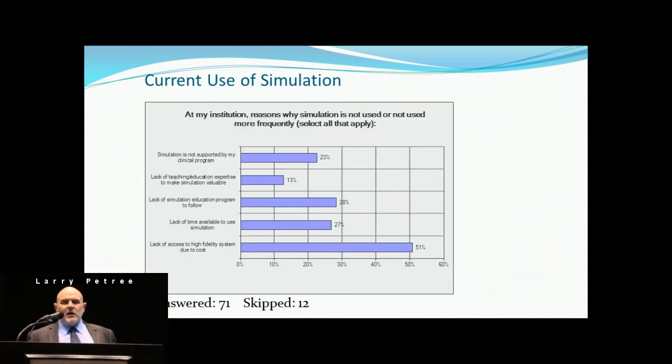So I want to switch to talk about the current use of simulation. How's it being applied today? I asked the question, at my institution, what are the reasons simulation is not used or not used more frequently? The largest response, down there at the bottom, is lack of access to a high-fidelity simulation system due to cost. And that came in at 51%. The next groups were that it is not supported in the clinical program, or there's a lack of a formal education program that I can open up and jump into and use.